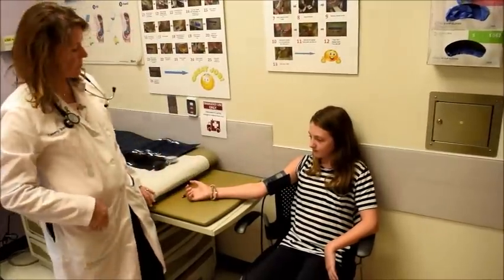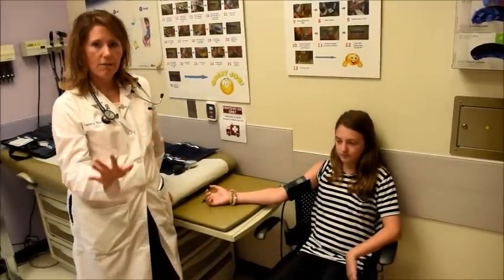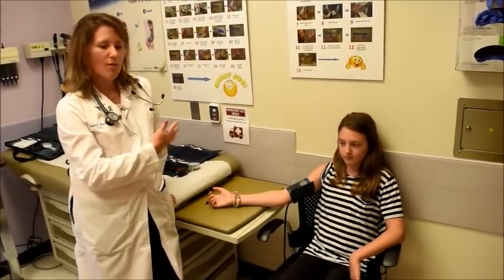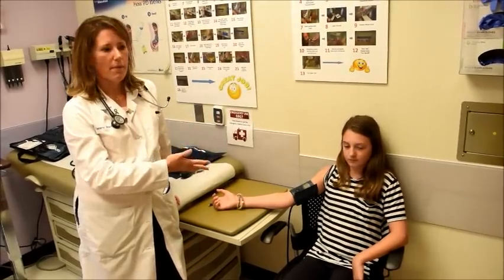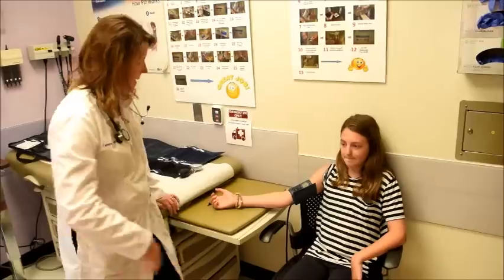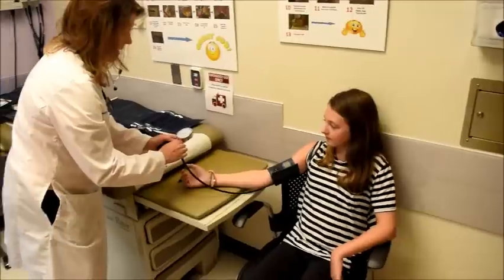And again, you want to make sure that the arm is situated so that their cubital fossa is at heart level. Okay, so what I would do at this point is I would set your timer for 5 minutes and leave the room. Particularly if you're dealing with a teenager, you want to make sure that there are no cell phones in the room and that they really are at rest for those 5 minutes. So then after the 5 minutes, you'll come on in and you'll attach the dial.